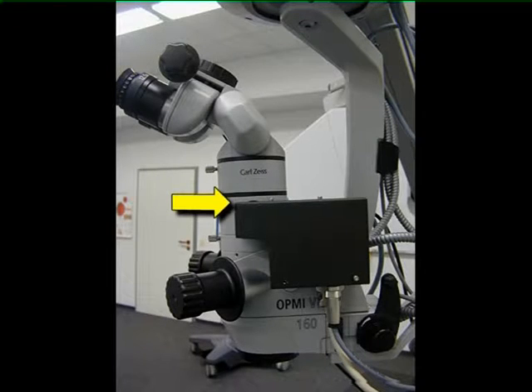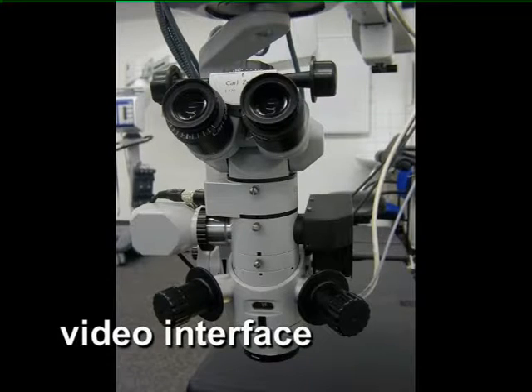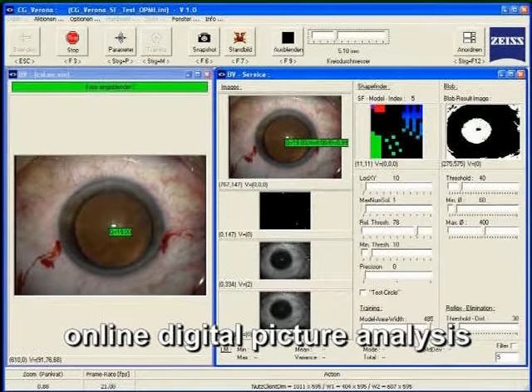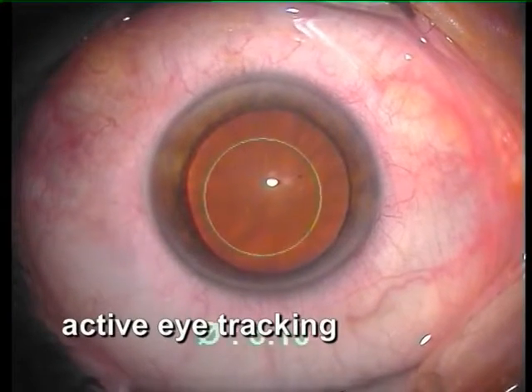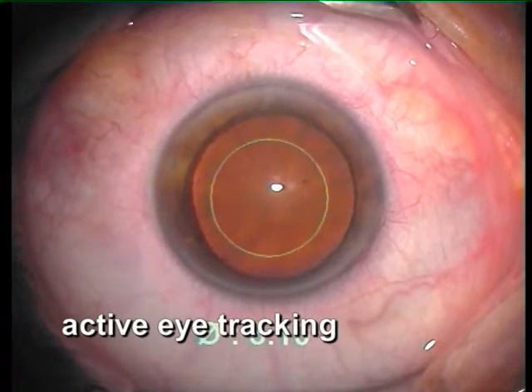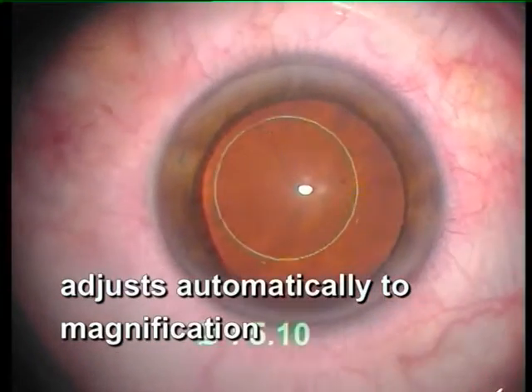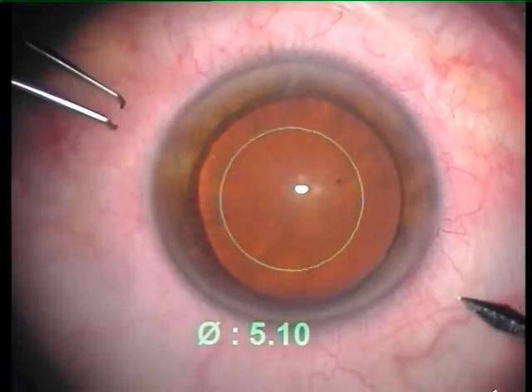Image processing software provides the surgeon with an orientation aid that assists in assessing the right size, shape, and location of the rexis for each individual eye. An active eye tracker ensures adequate following of the circle according to movements of the eye during surgical manipulation. The size and location of the circle can be individually and freely selected by the surgeon, and the size can be additionally projected as a numeric value on request.